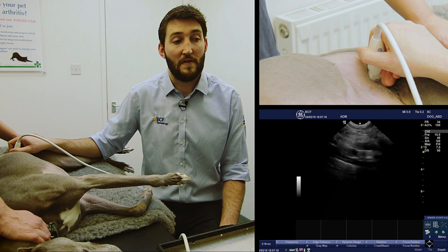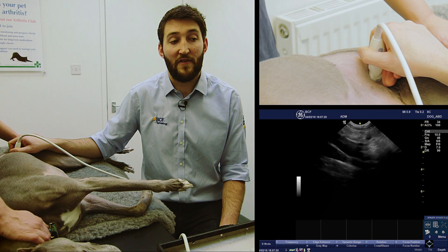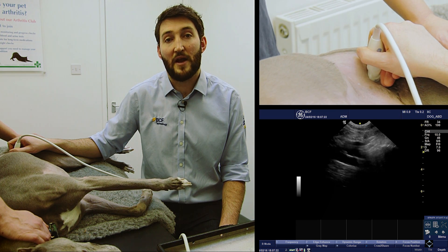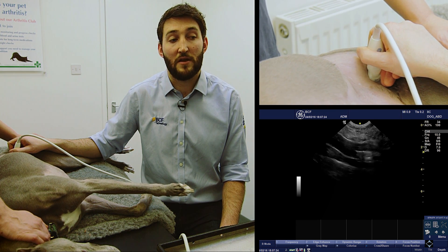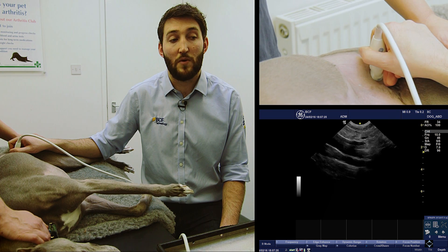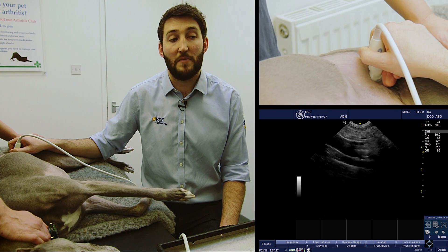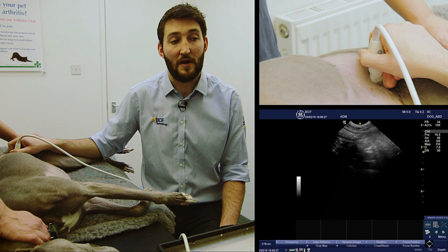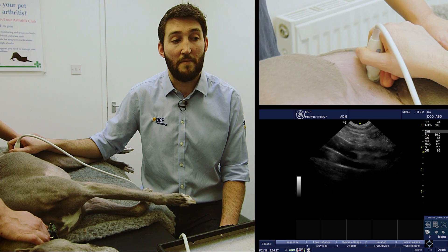Bearing in mind that the lymph nodes are usually long and thin and almost the same echogenicity as the surrounding tissue, it can be quite fiddly to find them. But just a little bit of patience and some fanning up and down and we should be able to see them.